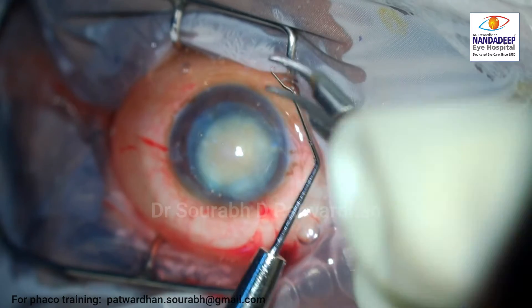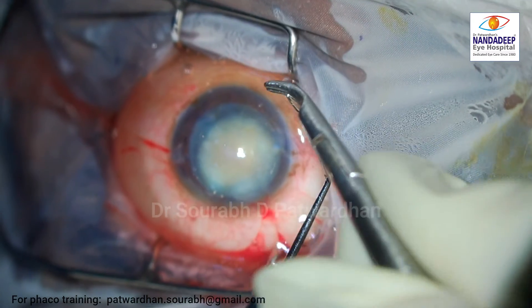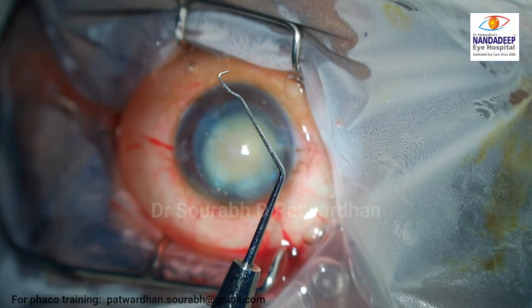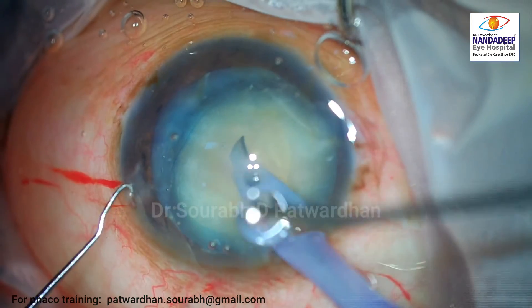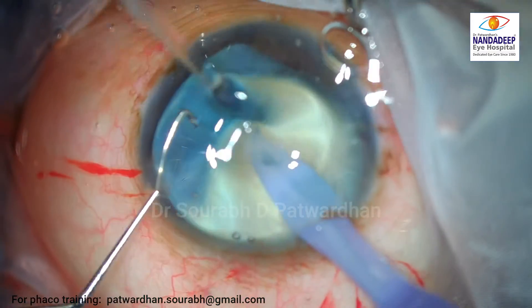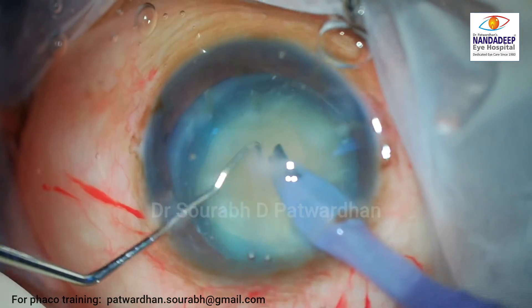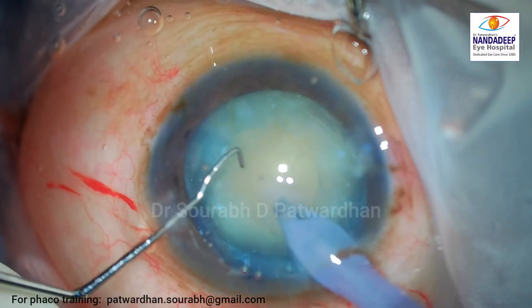The instrument is bent two millimeters first and then the opposite way one millimeter — this is a one-millimeter Sinskey hook which I am modifying into a kind of hook or chopper. I call it the hybrid chopper — Patvardhan's hybrid chopper — because it can be used for vertical chops, horizontal chops, as well as the trench divide technique.